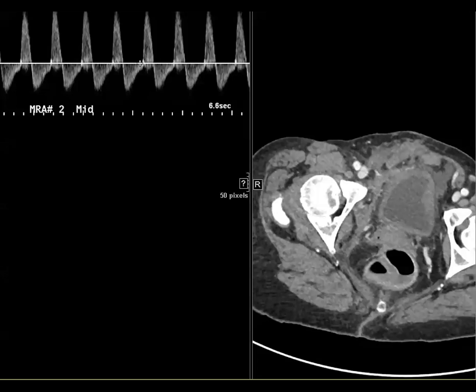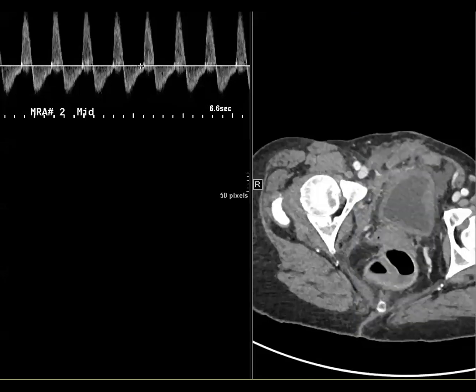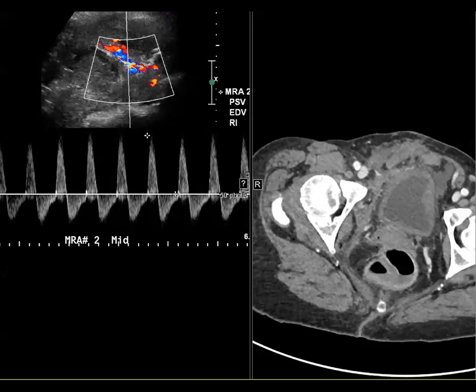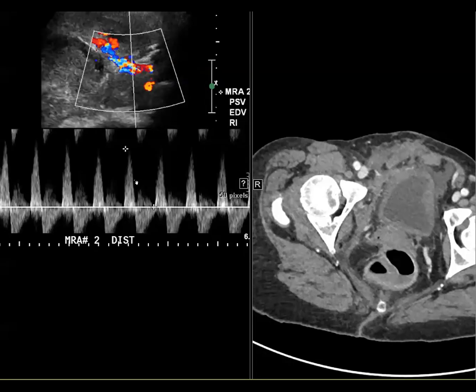Okay, I'm going to gingerly try to show an ultrasound without showing patient information. What do you guys think? This is a renal transplant ultrasound, and this is the waveform in the main renal artery. So what do you guys think about this? Reverse diastolic flow. Yep, reverse diastolic flow, and Rupa is saying RVT, or renal vein thrombosis. Excellent. So we were concerned about that. We saw a lot of reversal of flow in the main renal artery.